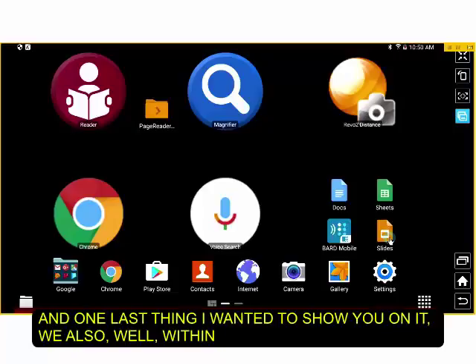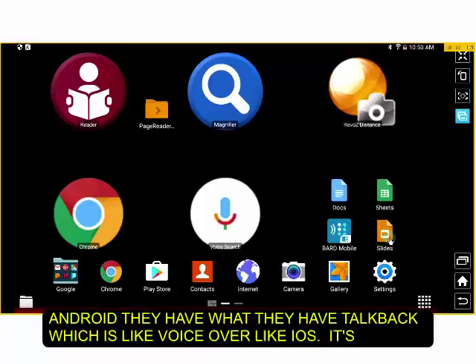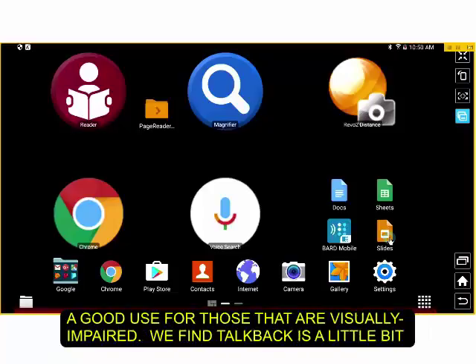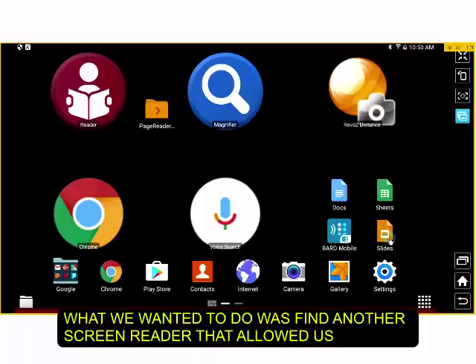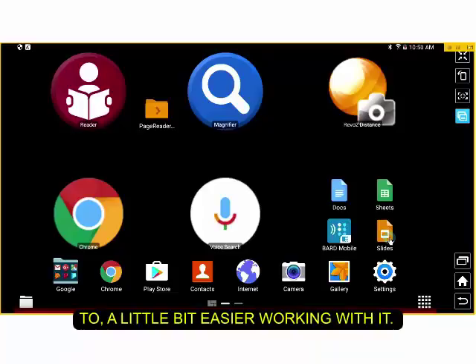Now, one last thing that I wanted to show you on it is, within Android they have what they call TalkBack, which is like VoiceOver from iOS. It's a good use for those that are visually impaired. We find TalkBack is a little bit harder to utilize because everything you do, you initiate and then activate with a double tap. So what we wanted to do was to find another screen reader that allowed us a little bit easier workings with it.